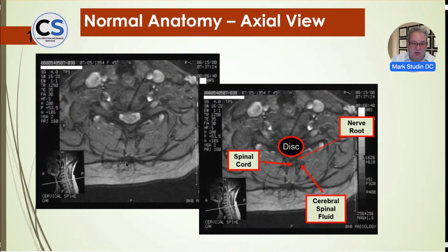But sequencing is critical. You need a T1 image, you need a T2 image, and you need a STIR image at the very least. You need proton density images in many issues. There's water suppressed, there's fat suppressed. There's so many different things, and it's really not that difficult, but you need at least 2 clean slices through the disc, not catching the bone, and that's really important.